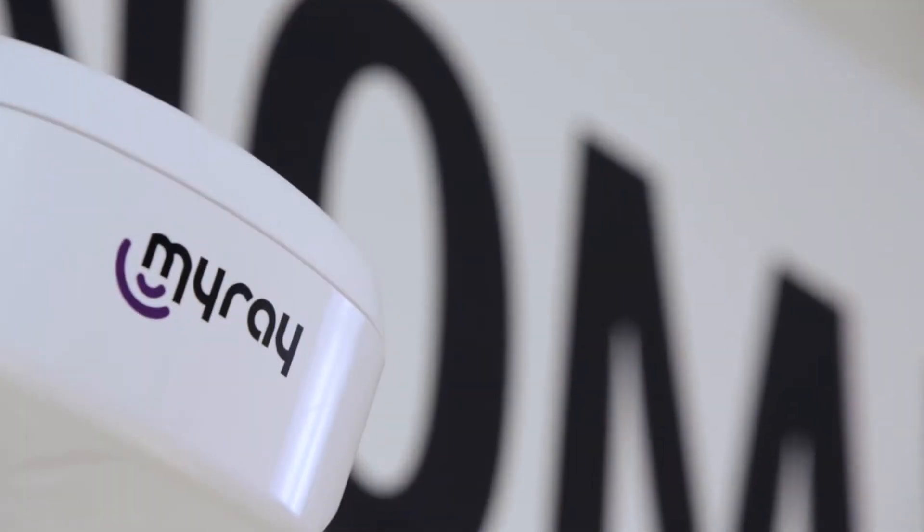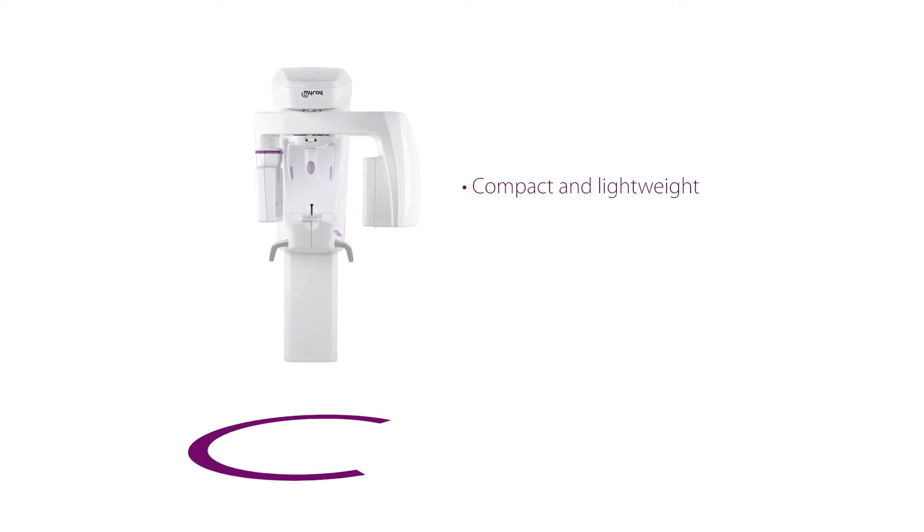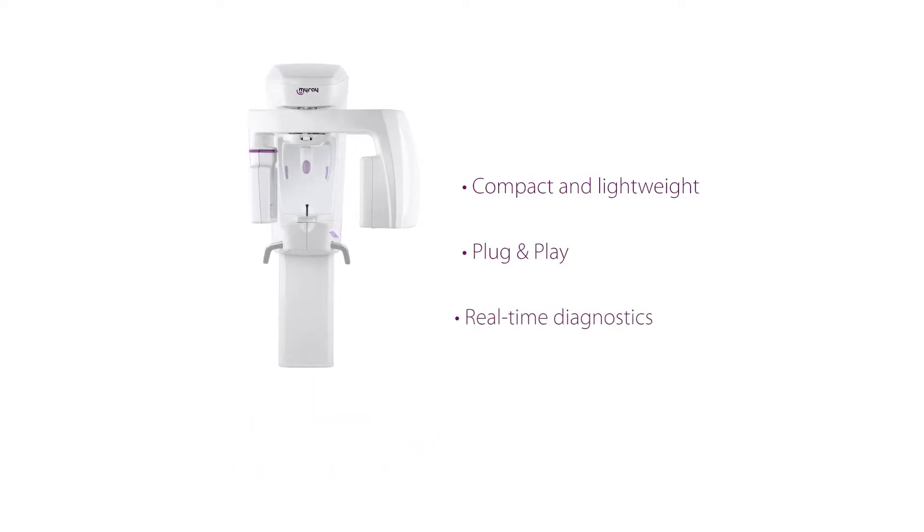Hyperion X5 is the first suspended 3D 2D system and the world's smallest. Innovative, versatile, easy to install and use.